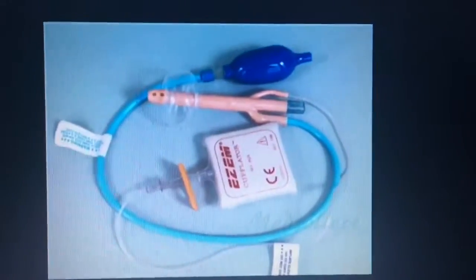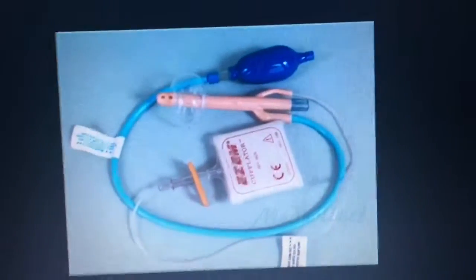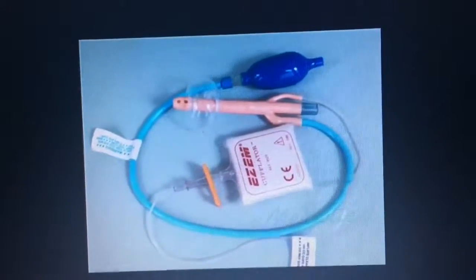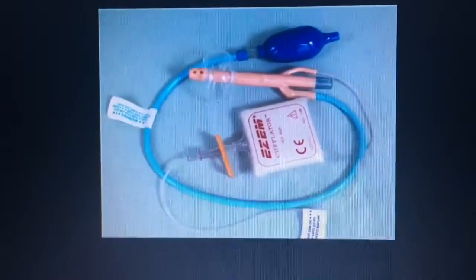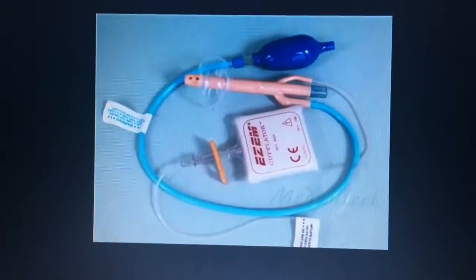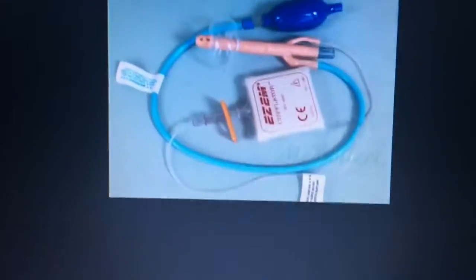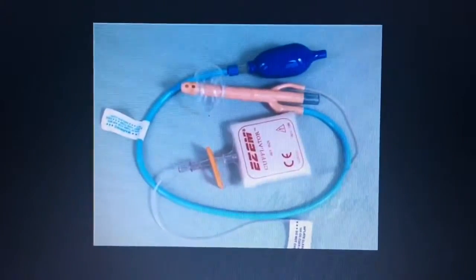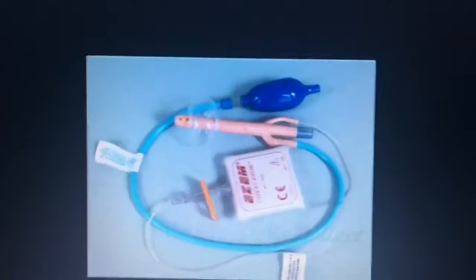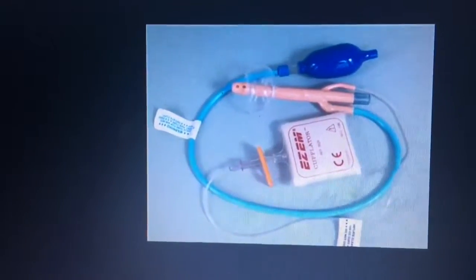Alright, so originally I had a video demonstrating how to insert the barium enema tip, no further than 4 inches, anterior, superior, but I erased my 7 minutes introducing myself to the patient, patient interaction, patient history, and the actual tipping and the scout image. So to start off with, my patient's name was Jared.